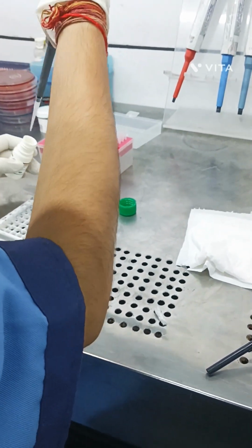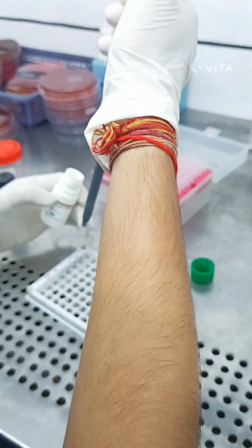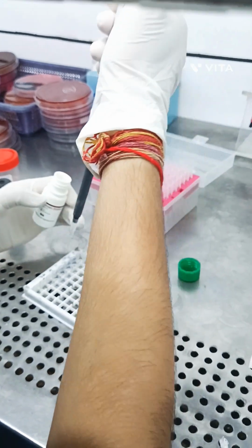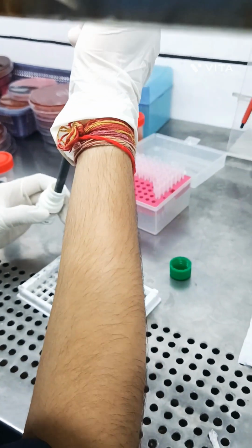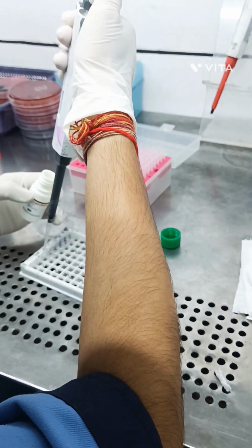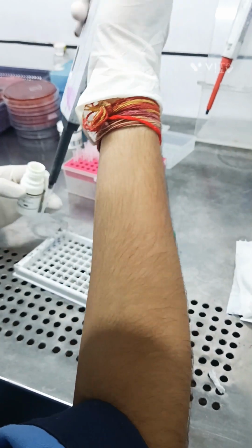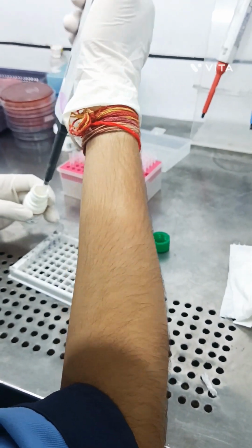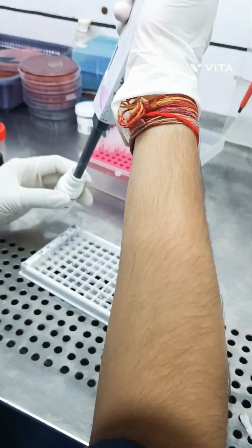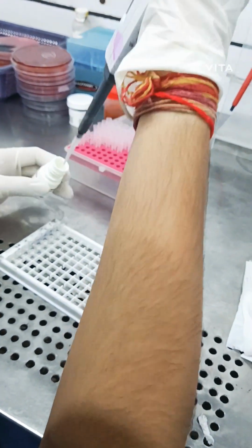The substrate is for color development. If color does not develop, it means our process is not working.